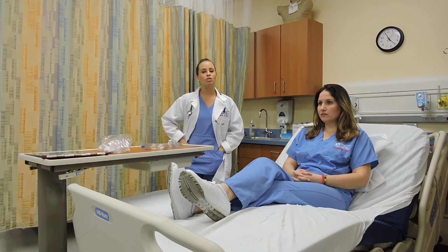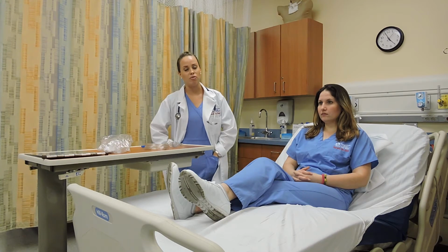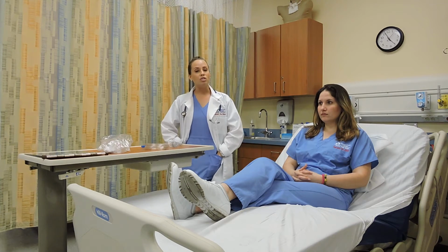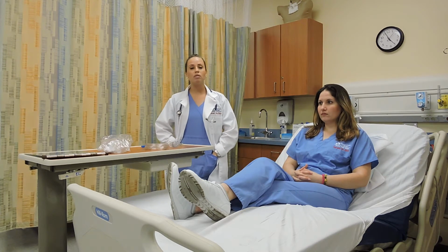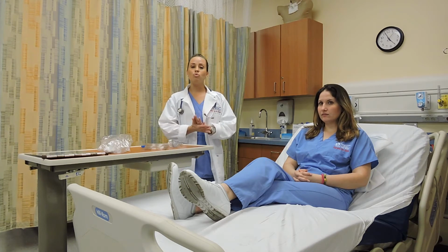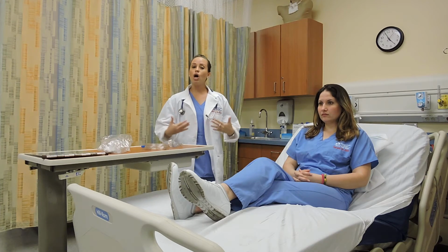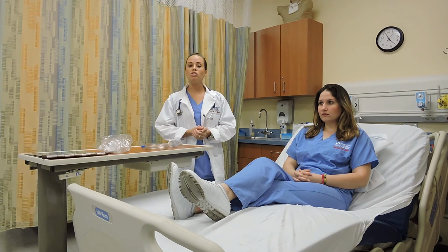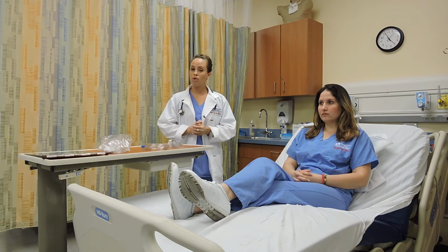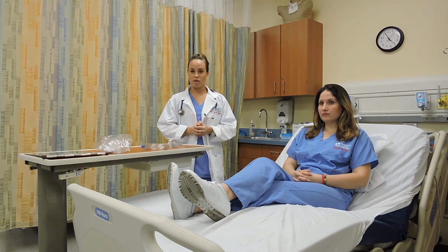Before I get into the procedure, let me address some important details about this therapy, such as indications, contraindications, and possible complications and hazards. EzPap is indicated to reduce air trapping in patients with asthma and COPD, to help mobilize retained secretions in patients with cystic fibrosis and chronic bronchitis, to prevent or reverse atelectasis, and to optimize the delivery of bronchodilators in patients receiving bronchial hygiene therapy.